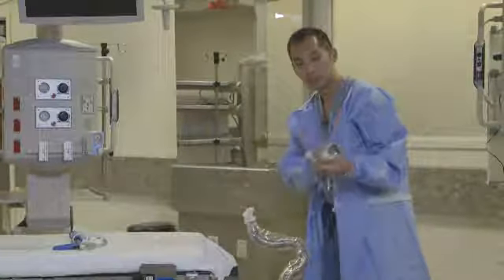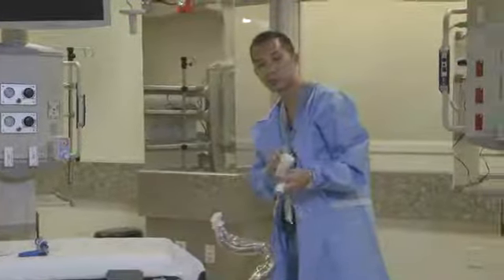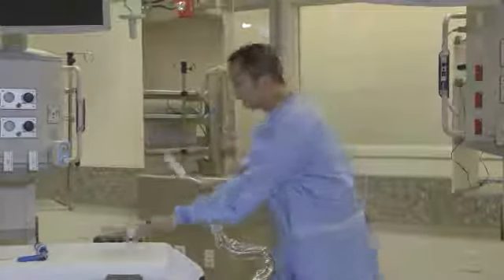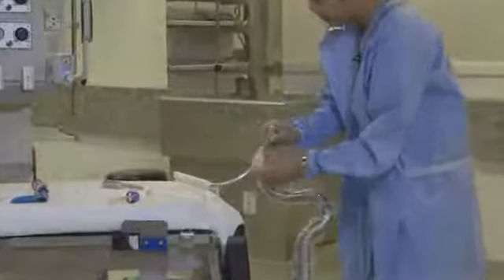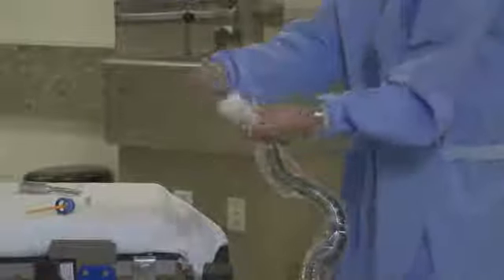So whether you're using this particular handle, the Advincula Arch with a Colpo-Pneumo occluder colpotomizer system, or even if you're going to be performing, for example, a procedure where you need to do a sacrocolpopexy and you have a tip adapted for that attached to the handle, same concept in terms of how you place that onto the device. Again, you're going to feel for that groove right there, and once it's in place, you can lock down the clamp, and again, you can make your adjustments, right? And then when you want to remove it, you just pop the clamp off the top, and then this comes right out, okay?